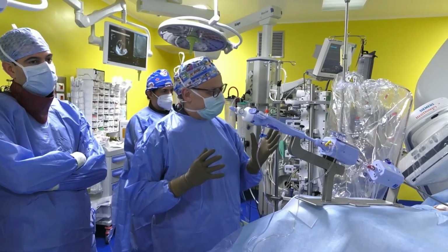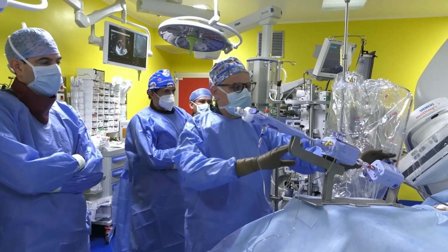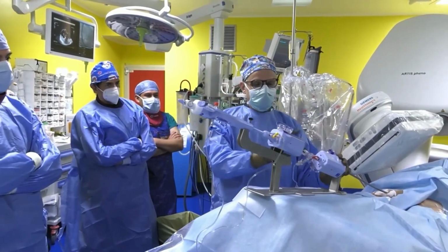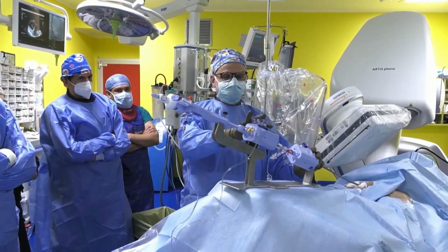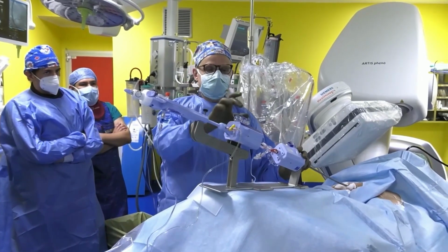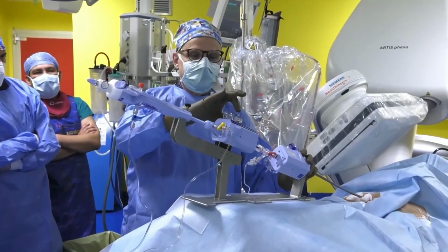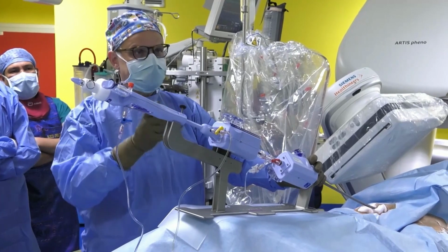So let's start with the case presentation. We are going to use a Generation 4 TriClip, so I would like to briefly introduce you to the modified system. The clip delivery system has only one steering position, which is flex and extension. Flexion obviously flexes towards the clip, towards the tricuspid.